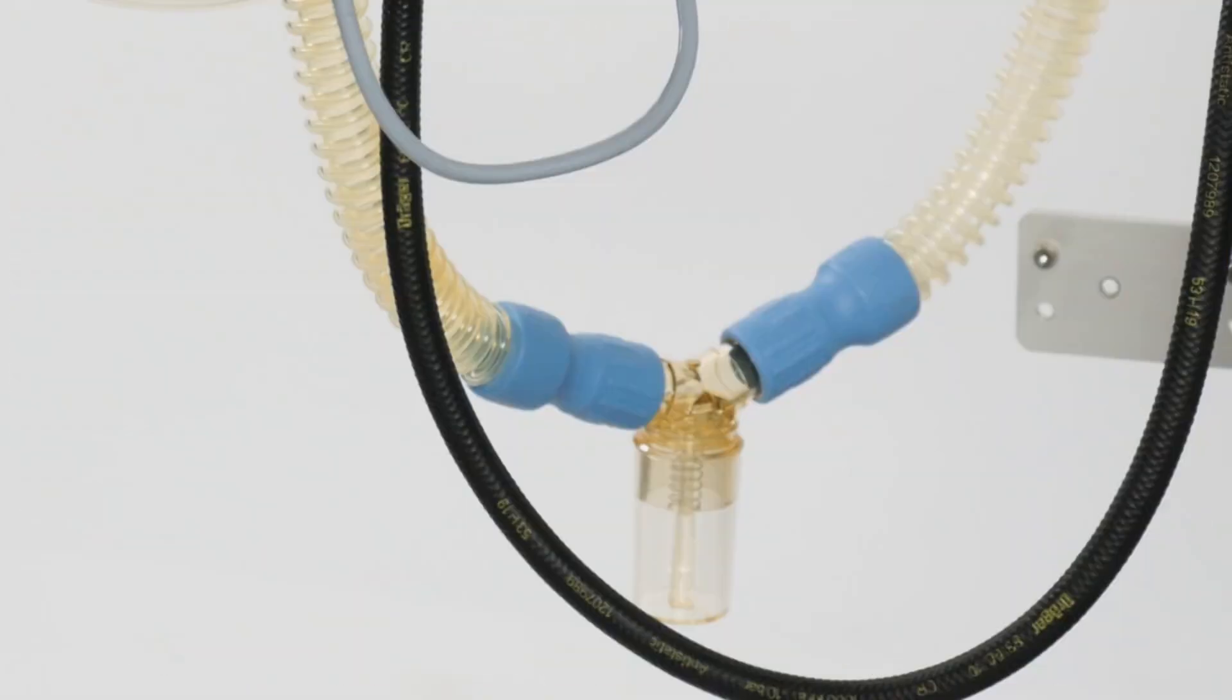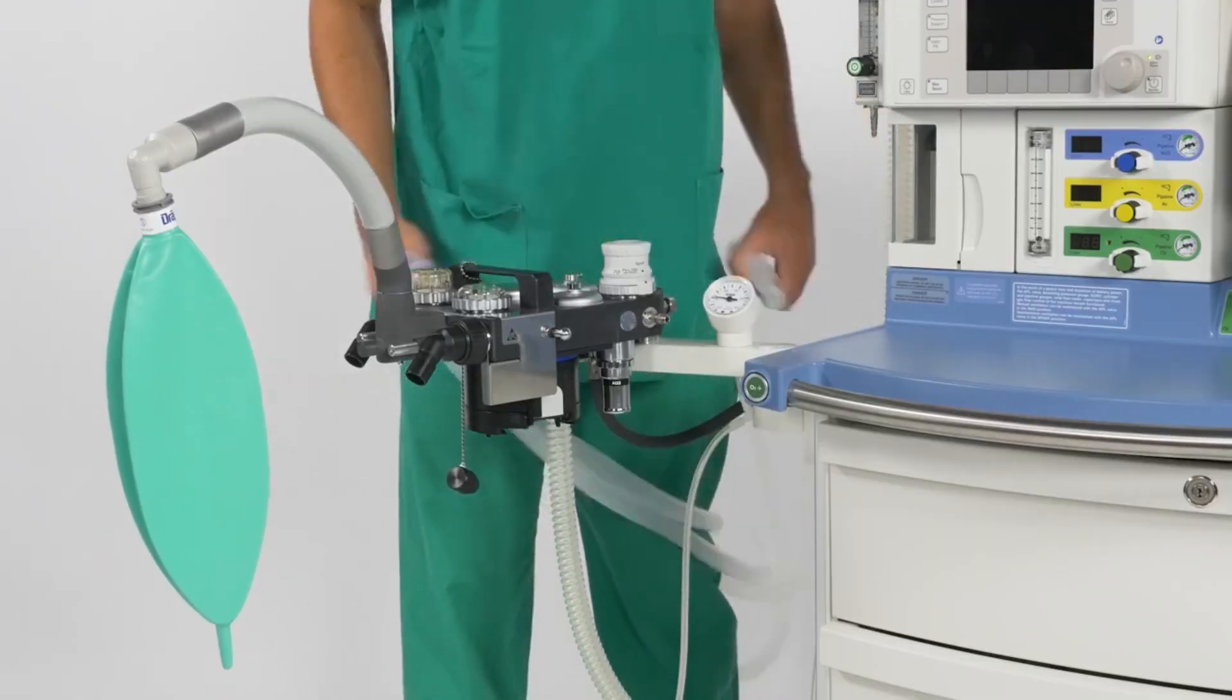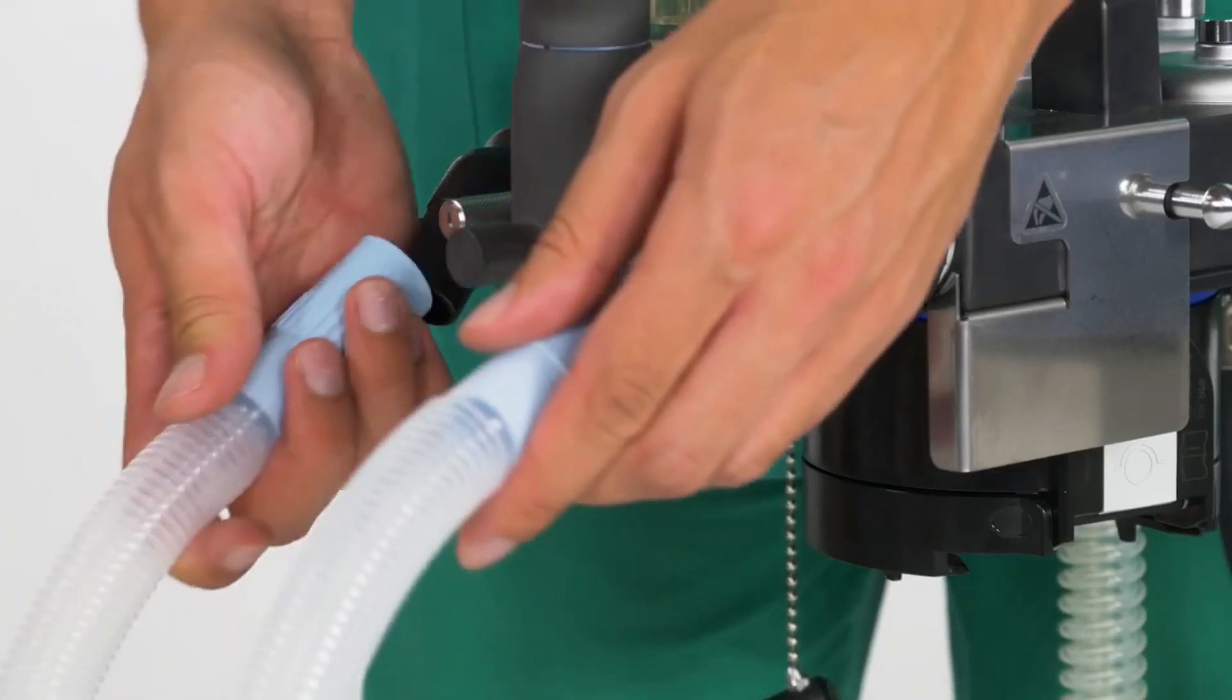And third is the inspiratory limb, which allows passage of fresh gas flow to the patient for inspiration. The expiratory limb allows passage of expired gas from the patient.